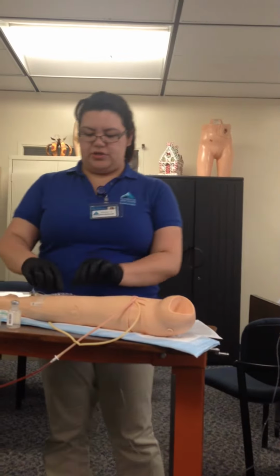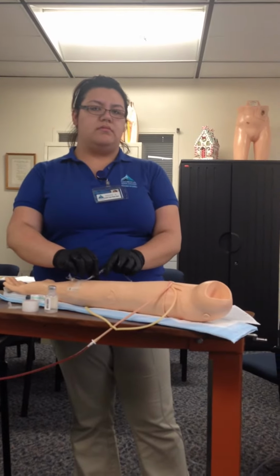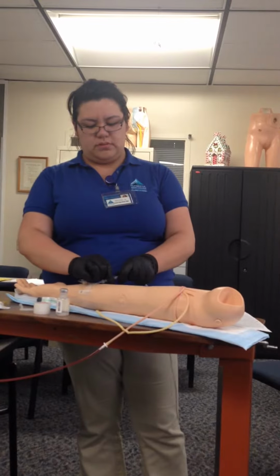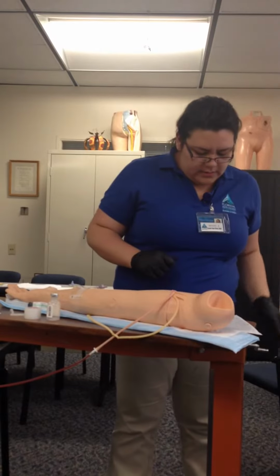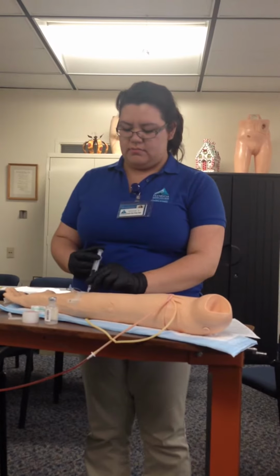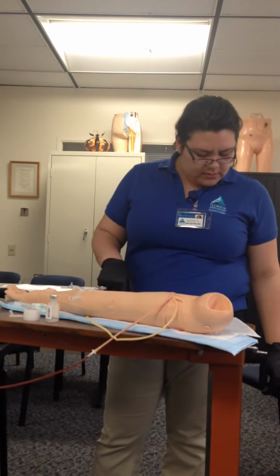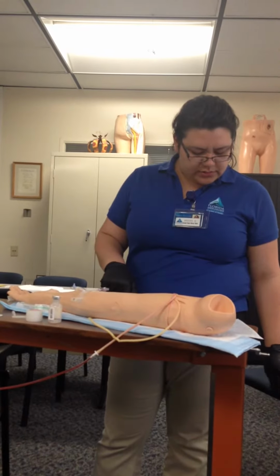Okay, so now I'm going to unclamp the tubing. It's going to infuse over 1 hour. I'm going to unclamp the tubing. And I'm going to flush my other 3 mLs in the line using the push stop method. Clamp simultaneously as you withdraw the syringe.